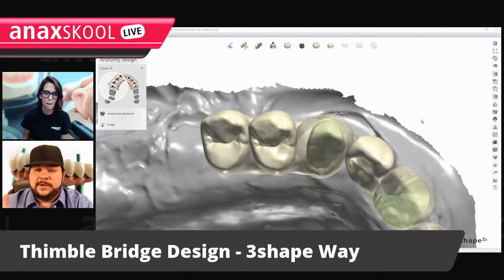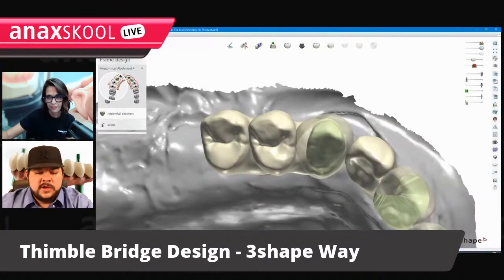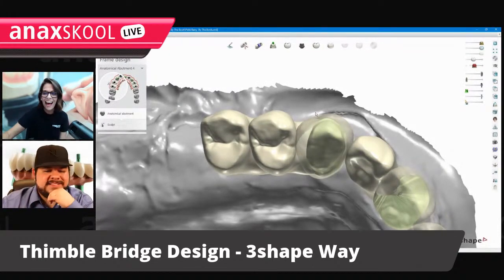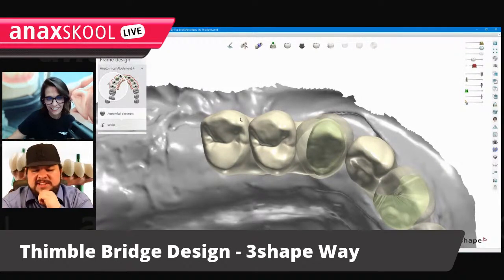All right. So now it's time for, oh, did it do this? Okay. So no, we're not even doing gingiva yet. We have to do the anatomical part. And this is where I quit. I said, no, thanks. So it's still catching up. You can see the issues. This is where the error was, and now I'm hitting redesign to get the error.